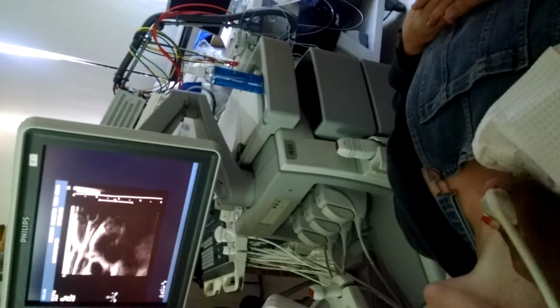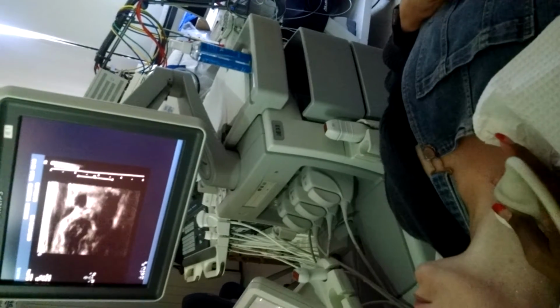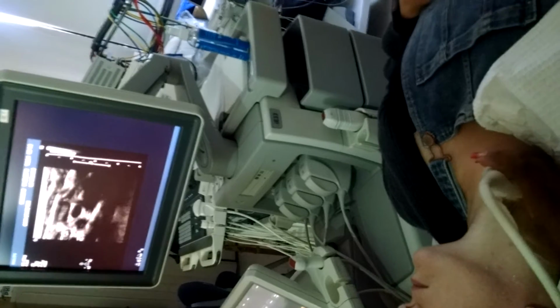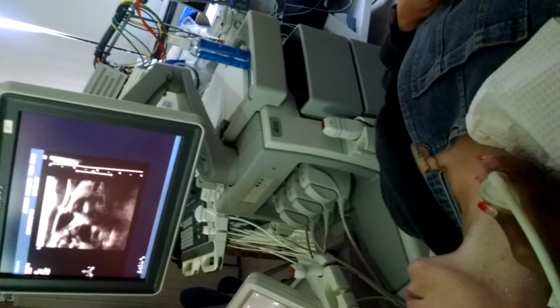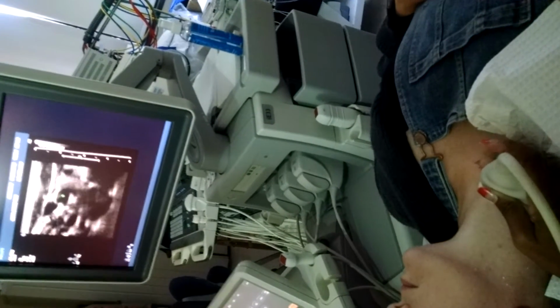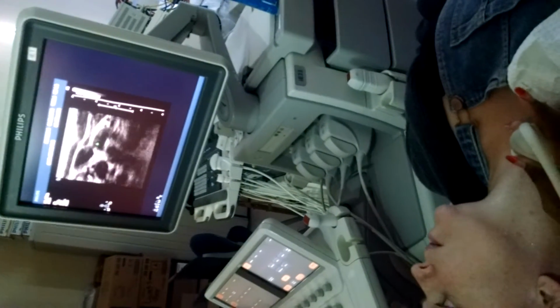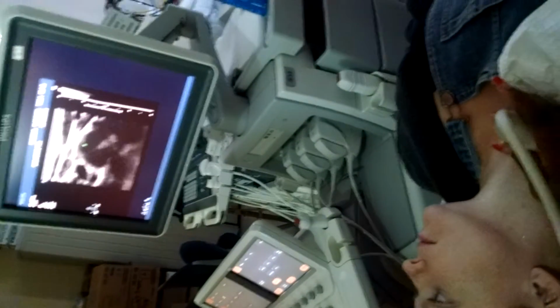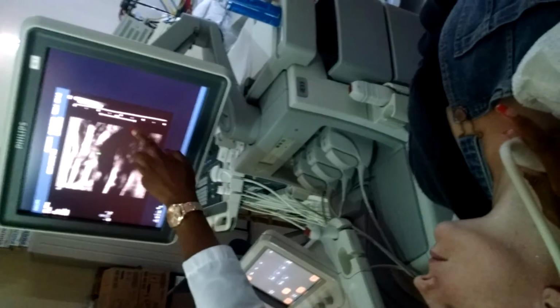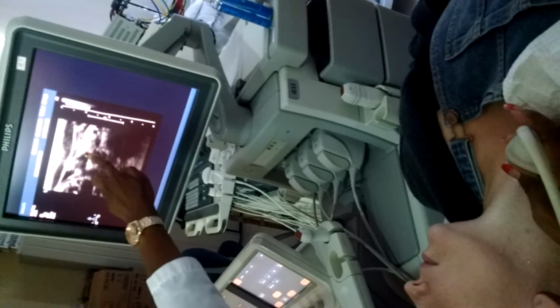Let me go back to B mode. Okay, so here is your common. So the bigger one is going to be here, your common, right? Follow the common because the innominate divides into the what? The common and the subclavian. Right. So if I follow that down, this is going to be the innominate coming off the arch. The subclavian is going to go towards the arm, and the common is going to come up here.